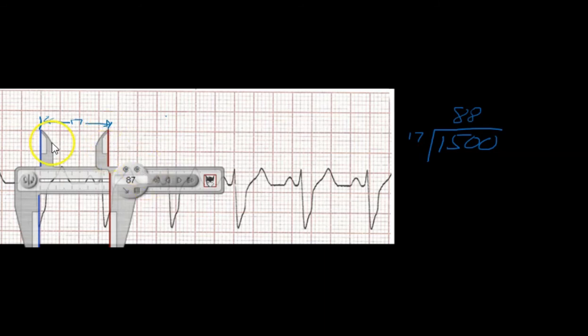So, again, if I were to do this, you know, real quick, it would be 300, 150, 100. Here's 75. I got my exact rate here at 88. So my atrial rate is at 88.